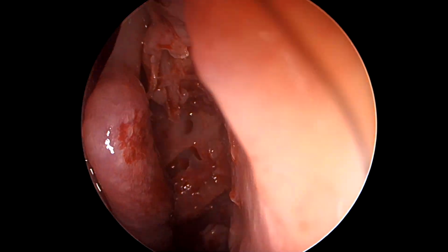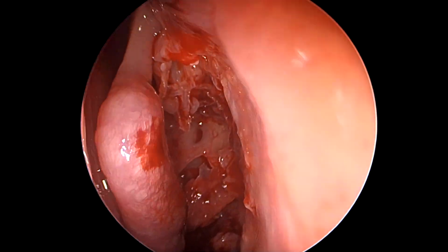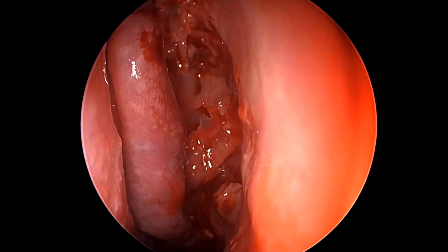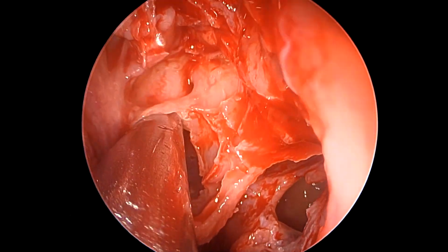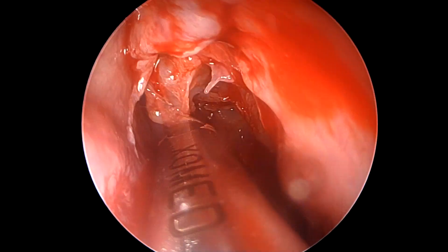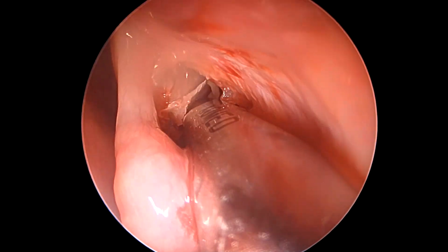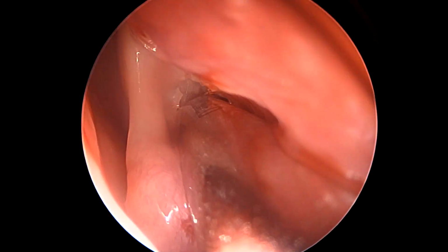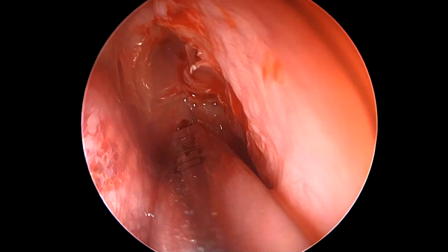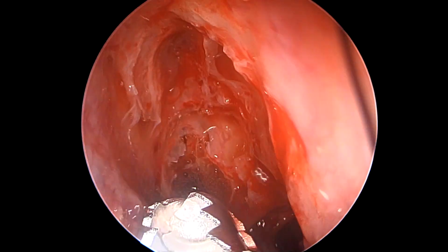This is the most superior part of the uncinate process, which is also many times the posterior wall of the agger nasi, and this is now being removed. And now we can see that we have an access toward the basal lamella as well, which we have now penetrated using our straight microdebrider blade. As we penetrate the basal lamella, we also remove the superior attachment of the uncinate process here. We can see the open agger nasi cell, which happens to be just underneath the axilla of the middle turbinate.